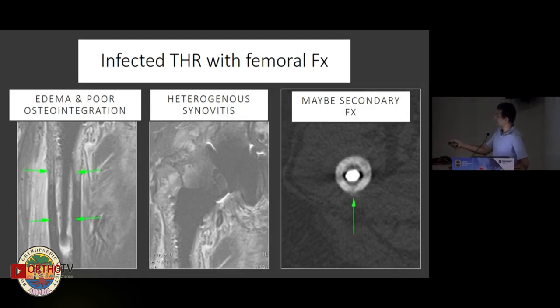Here's an example of an infected total hip. You can clearly see poor osteointegration, edema and irregularity around the cortical shaft, and synovitis along the hip. On CT, you can also see an evolving periprosthetic fracture.